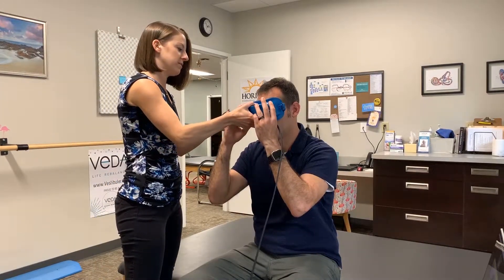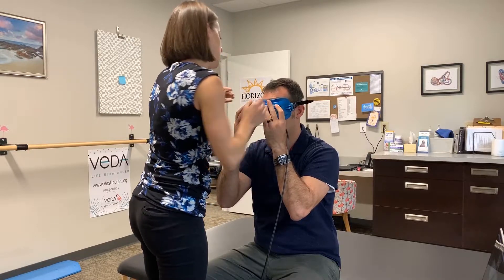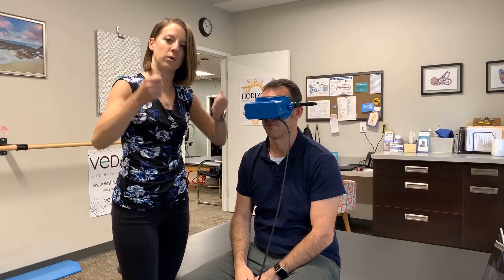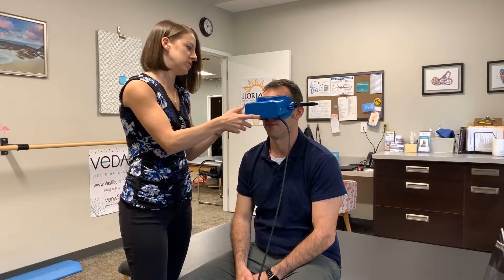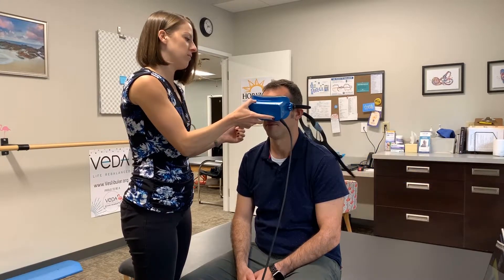One of the new features of the new goggles is the rubber strap that has clippable inserts on the side, which is nice for easy release to get the patient out of the goggles. I've also found it useful for putting patients in the goggles — I'll have the patient hold the goggles up to their face, bring the cord around and clip into the side, then adjust the straps. That way I can account for a ponytail without difficulty, and the patient is in there nice and secure. The buckles on the side are really easy to adjust, either loosen or pull tight, and to get the patient out it's a quick release.